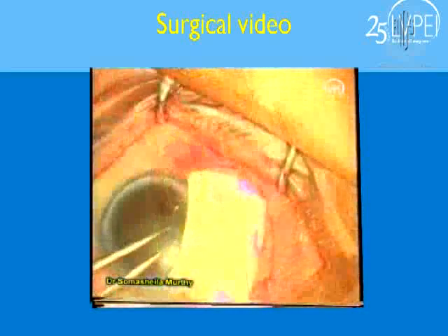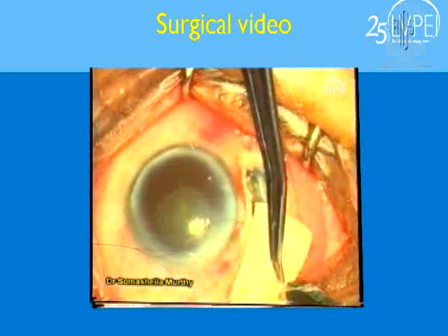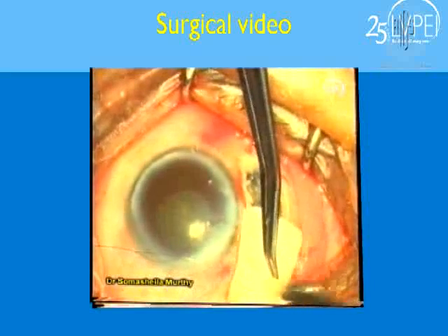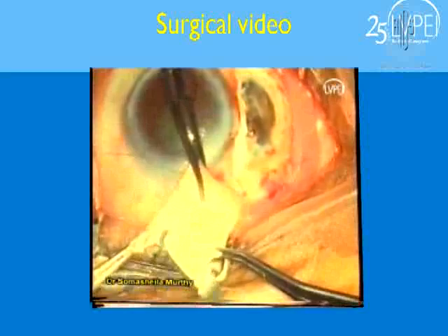Freehand measure it, and this is preserved sclera, which is really very thick if you want to put the entire sclera in place. So what you can do is make it half thickness by a very simple freehand technique with the help of an assistant, or with a crescent knife, or simply a 15-number blade. And once you do that, you can suture this in place.